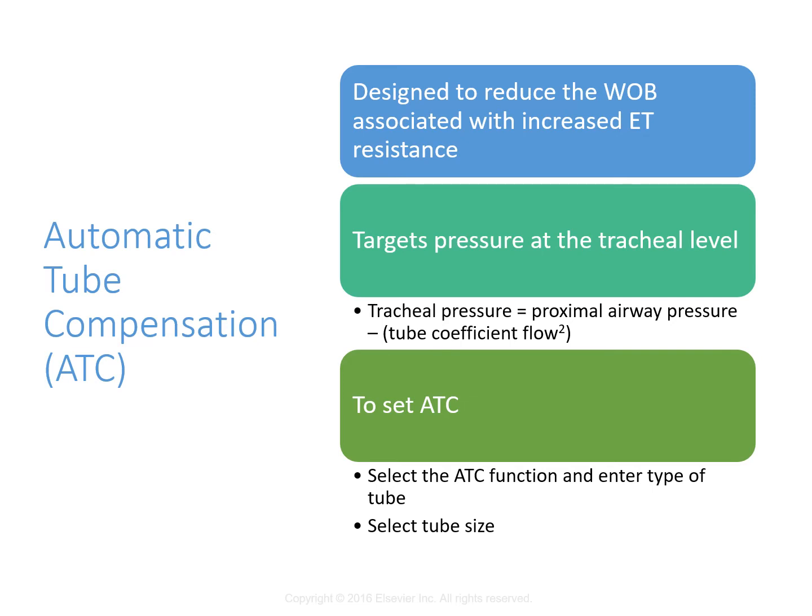So anything like kinks in the tube can factor into that, biting the tube. Anything there will make for a high minute ventilation, and that will increase the spontaneous work of breathing for the patient. So how do we get rid of all the airway resistance of the tube? Well, we can use low levels of pressure support to help compensate for that increased work of breathing, but we don't know. We're just sort of titrating to effect when we're doing the pressure support mode.